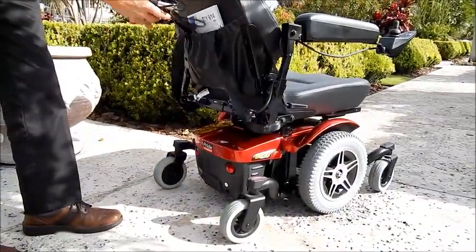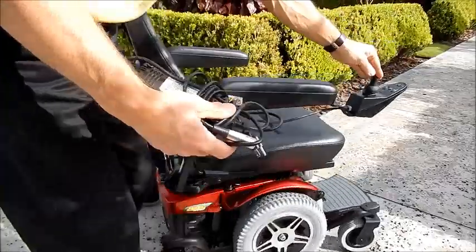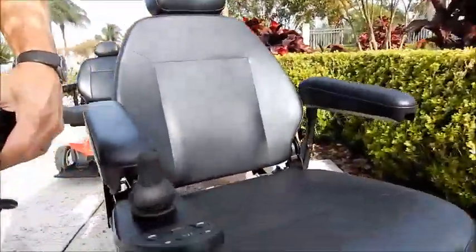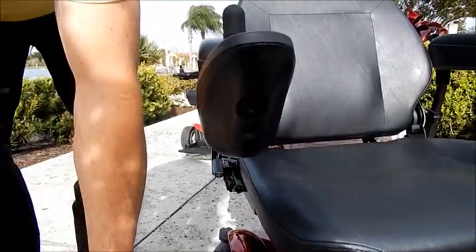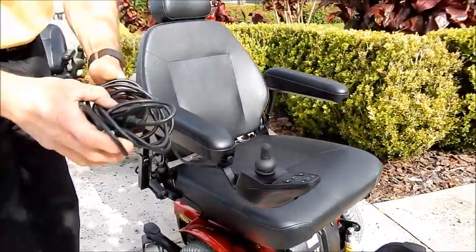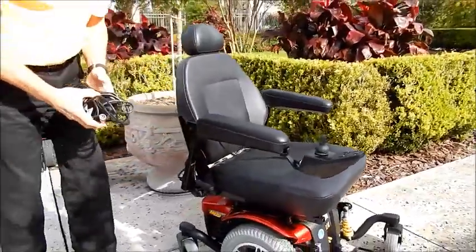To charge this chair, all you have to do is plug the charger in front of the joystick and plug the other plug in the wall and leave the charger on the ground. That's all you have to do. When the chair is full, the charger will stop charging, so it will not overcharge the batteries.